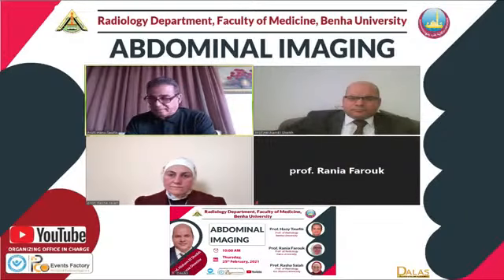لو أقل من 1 سم بنسميها الأولانية سوبرا، دي juxtasphincteric، معناها أقل من 1 سم من الـ anorectal ring أو السفنكتر، فده بيتعمل له partial intersphincteric resection preserving يعني preserving باقي الأسفنكتر. لو واخد الـ internal sphincter يبقى intersphincteric، ده ممكن يتعمل له total intersphincteric dissection. إنما لو واخد بقى الـ external sphincter ده بنسميه transsphincteric، وده بيبقى عايز abdominoperineal resection، مفيش بقى sphincter preserving في حالة زي كده.